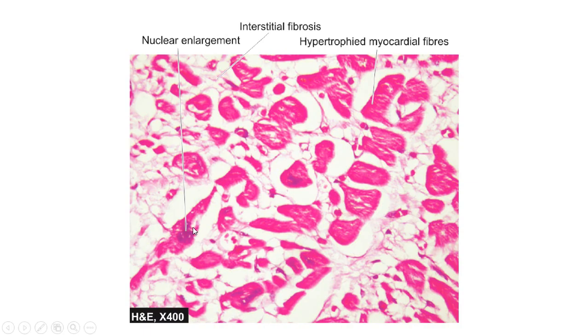First, the characteristic can be enlargement of the nucleus, and then the muscle fibers will be close to each other.